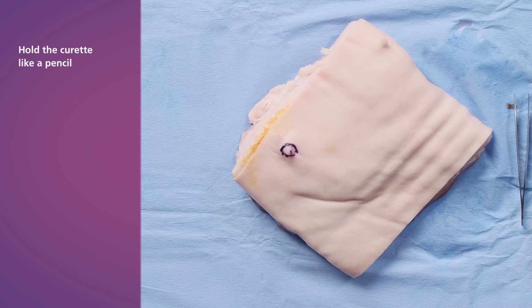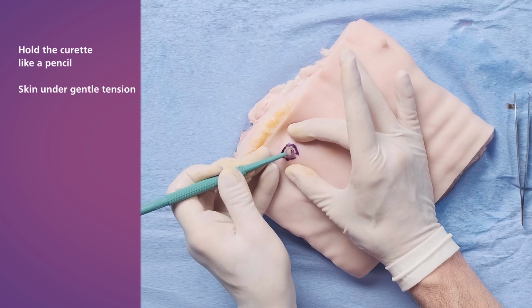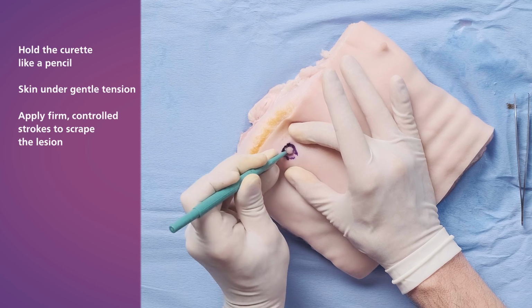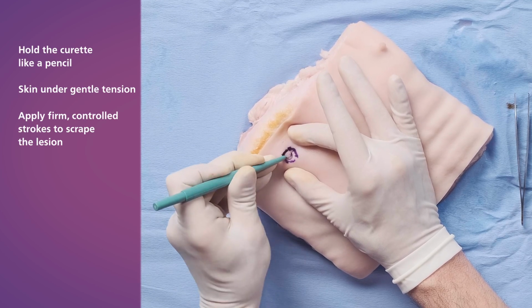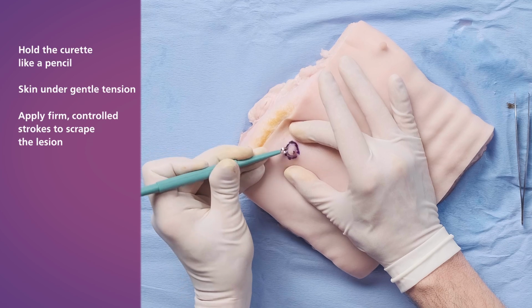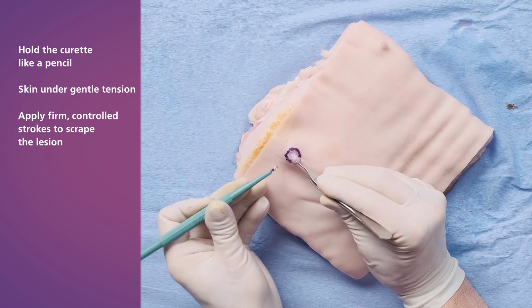Hold the curette like a pencil in your dominant hand, with the skin under gentle tension from your non-dominant hand. Then apply firm, controlled strokes to scrape the lesion. Continue curetting until the tissue feels firm under the instrument and no obvious friable tumour remains. The curetted tissue should be collected for histology if indicated. Continue this motion, ensuring that you curette in all directions.